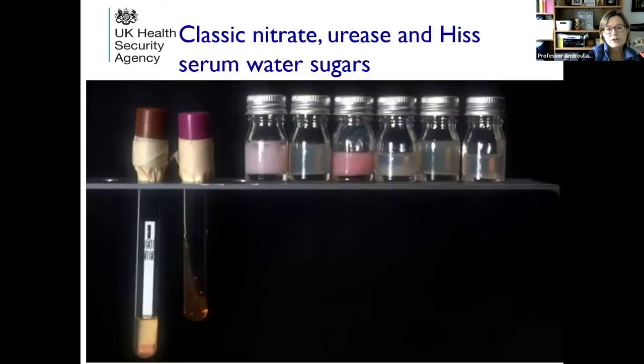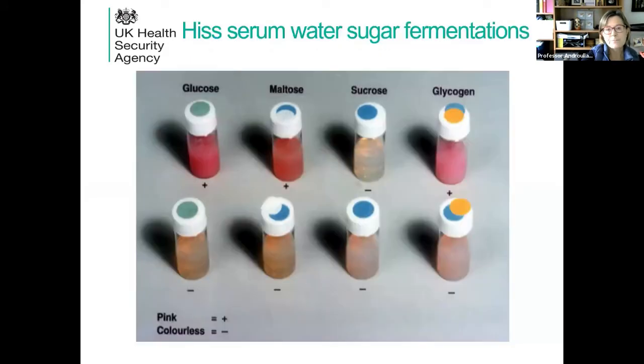And these are the classic sugars that some labs, particularly those labs in developing countries, are still using. So nitrate broth, urea, and classic sugars. These are the serum water sugars, Hiss's serum water sugars. And this is what they look like when they are positive.